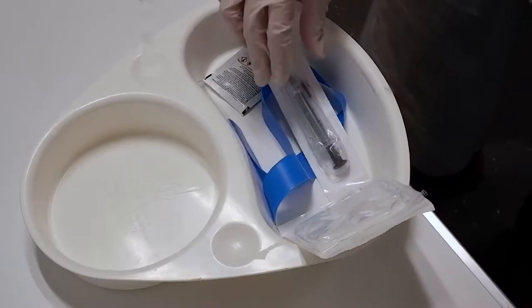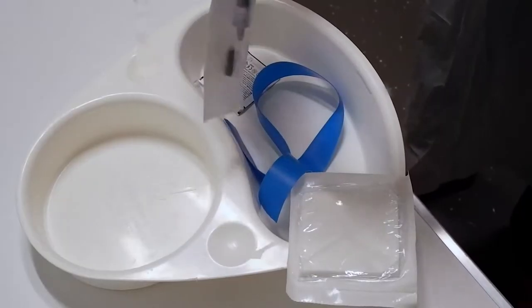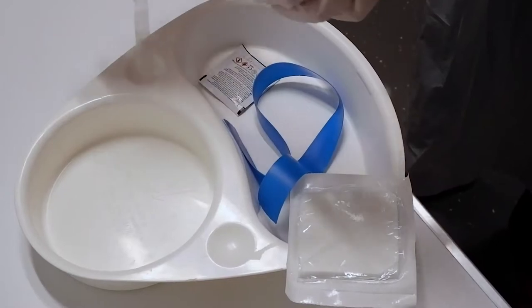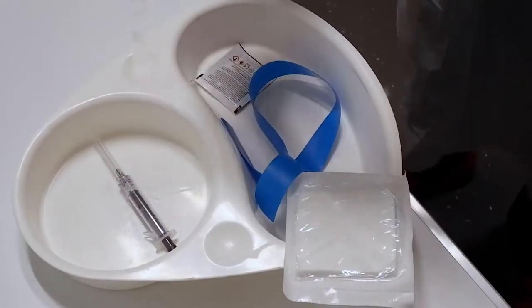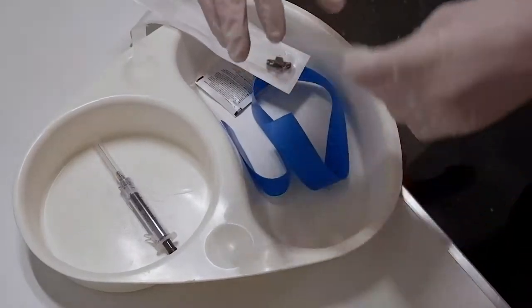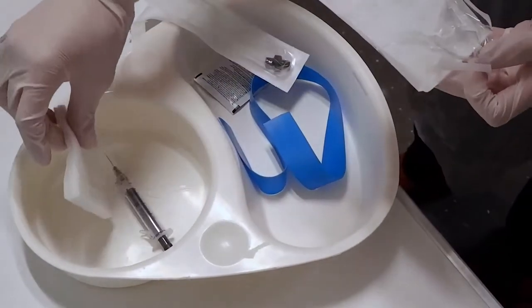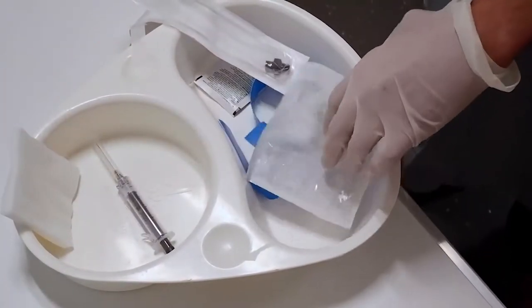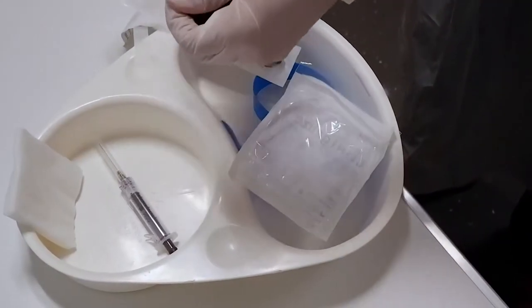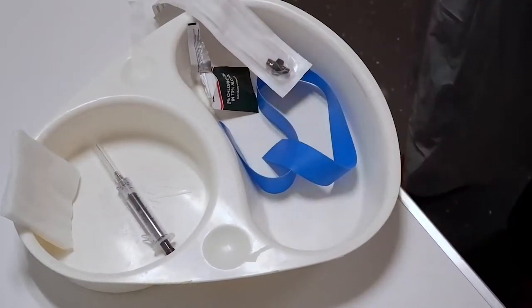In this video we have used a tray with two chambers. We use one chamber for equipment out of the packet, and we will open equipment which is in its packaging — in this case the VBG needle and syringe and the gauze — into the other chamber. Keep the bung inside the packaging to keep it safe, as you will require it after collecting the blood sample.